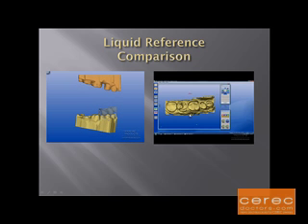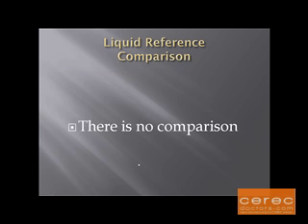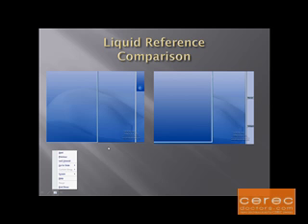You will see on the left now that we finally have the mandibular arch stitched with the Buckle Bite images. We will bring it up to the maxillary teeth, which tend to stitch easier. And now we have everything stitched. So this head-to-head comparison, there's no comparison. Arches with Liquid Reference win every time, and so do you.